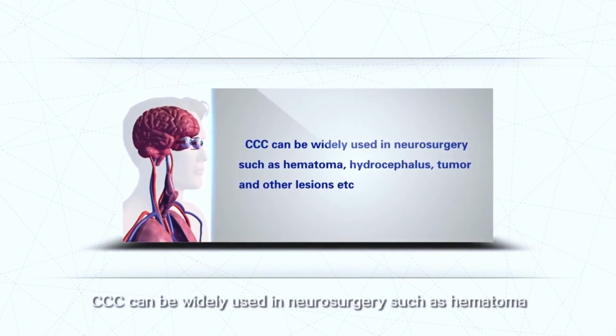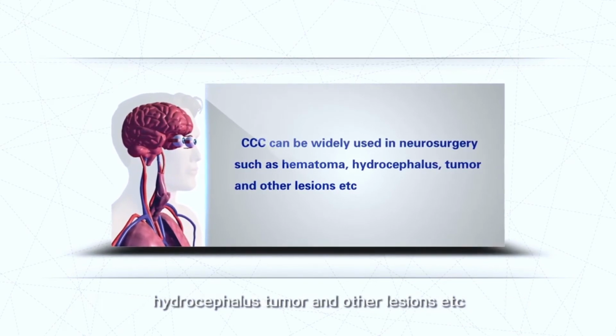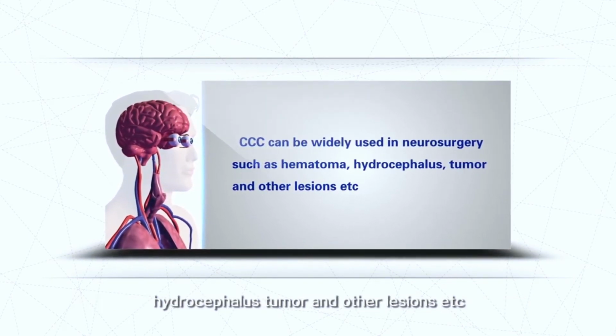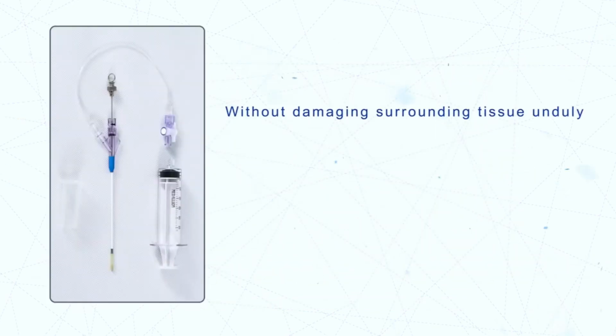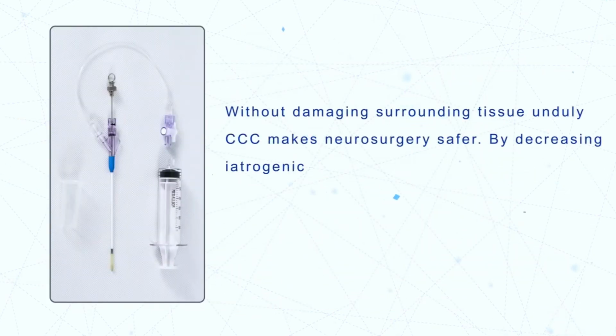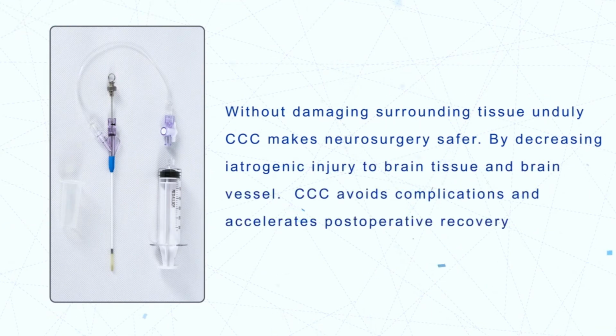CCC can be widely used in neurosurgery, such as hematoma, hydrocephalus, tumor, and other lesions. Without damaging surrounding tissue unduly, CCC makes neurosurgery safer by decreasing iatrogenic injury to brain tissue and brain vessels. CCC avoids complications and accelerates post-operative recovery.